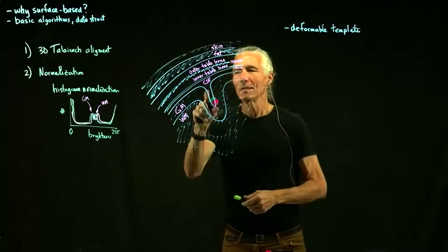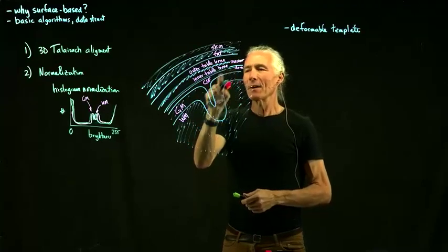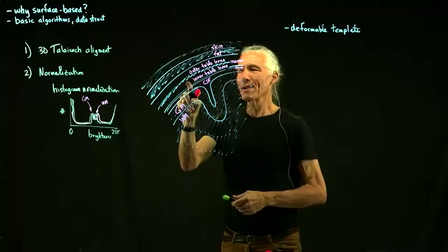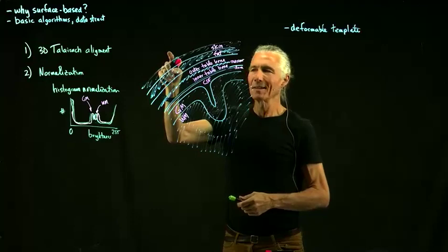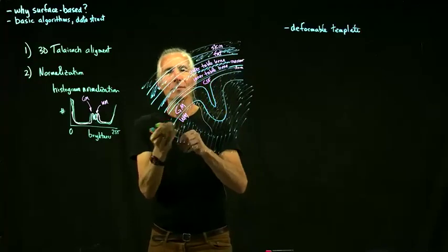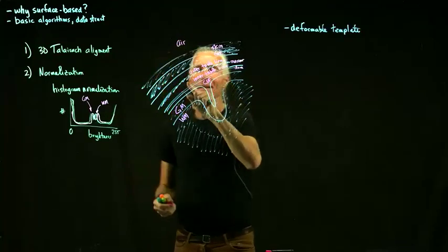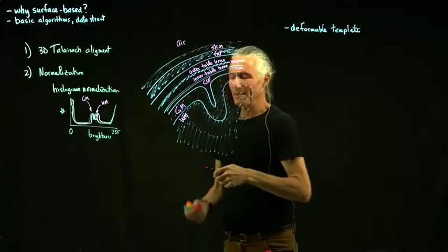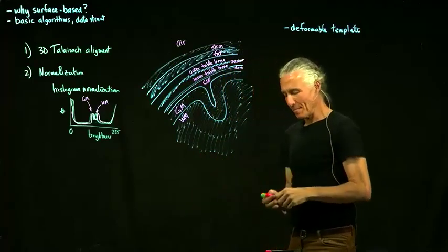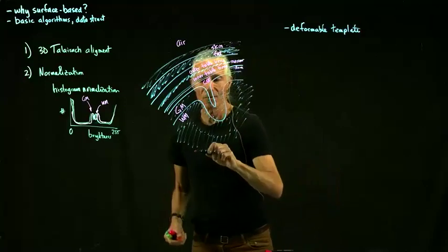try to get it to find that black layer there. Of course, the problem is there's another black layer there, and another black layer, and then another black out here. So all of those: the air is black, but the skull is black, and the inner table of bone is black, and the CSF is black. But if we started at the middle, I'm just going to draw it in 2D.